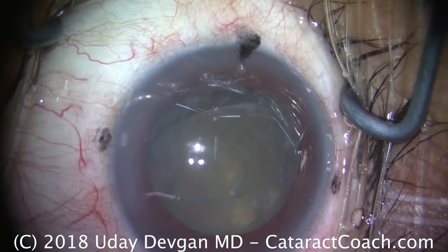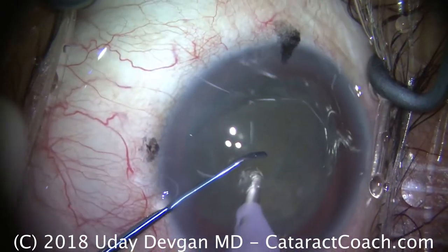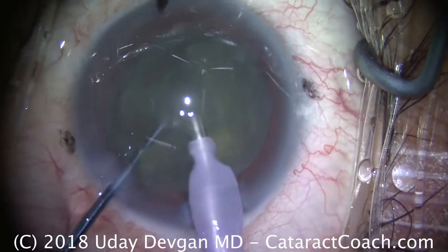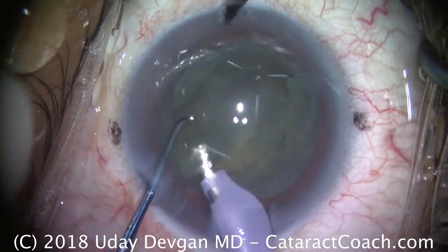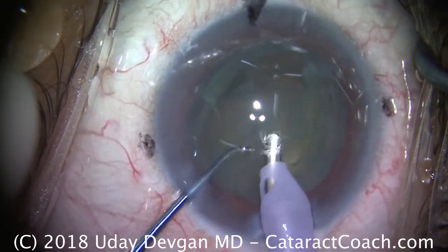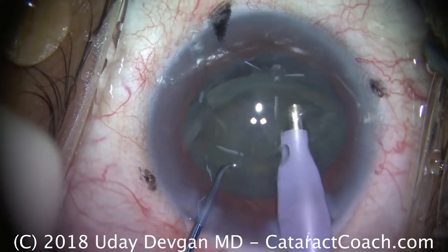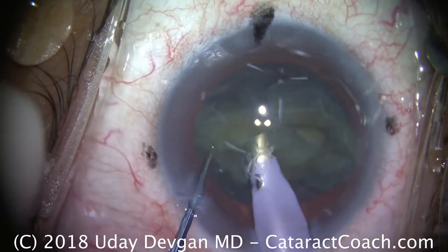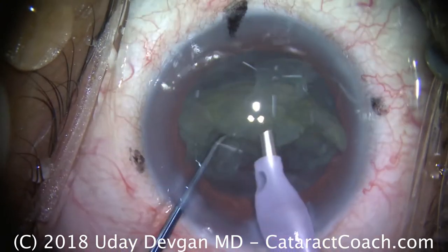The phaco probe is being placed in the eye, followed by the chopper. This is a high vacuum, high flow setting. We put the chopper behind the cataract and chop it — that's the flip and chop. We flipped it out of the capsular bag and chopped it. One quadrant's already gone; there's the second quadrant. Now we're being very careful — there's a little bit of the epinuclear shell. The second half is sitting in the capsular bag, and we need to slowly bring it out of the capsular bag before fully applying emulsification power to it. Now it's out of the bag, so we can give more vacuum, have more flow, and apply more ultrasonic energy.